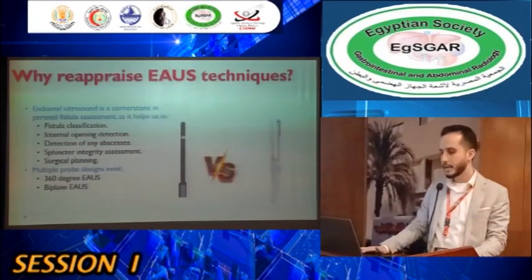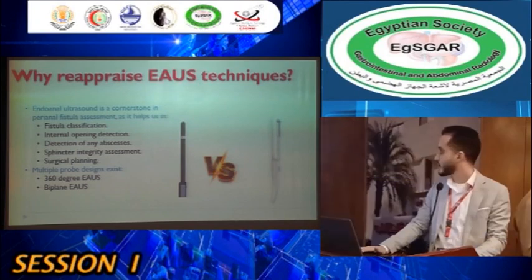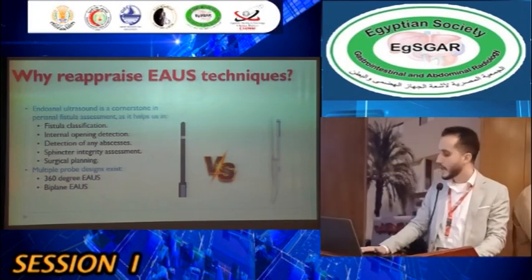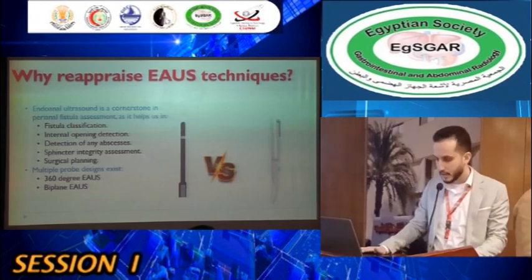First, why reappraise endoanal ultrasound techniques? Endoanal ultrasound is a cornerstone in perianal fistula assessment that helps us in fistula classification, internal opening detection, detection of any abscesses, sphincter integrity assessment, and surgical planning.